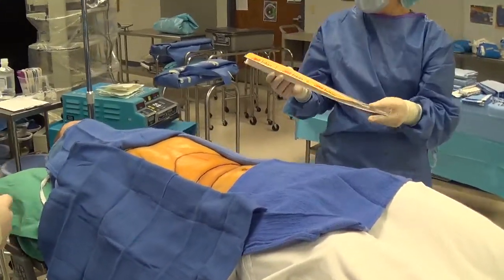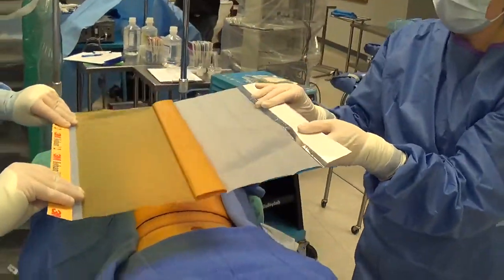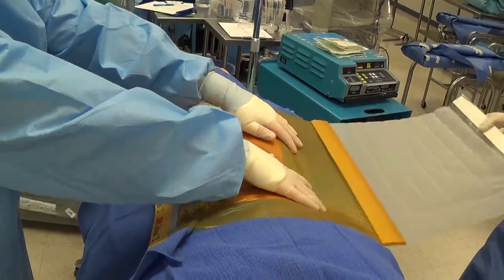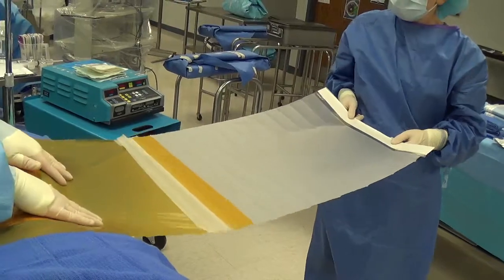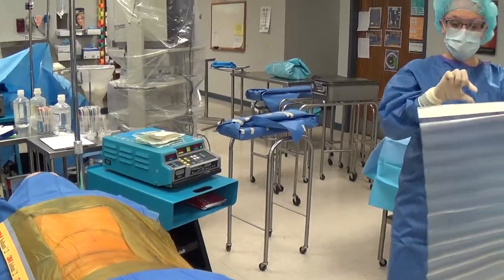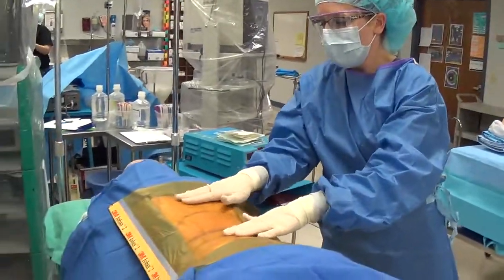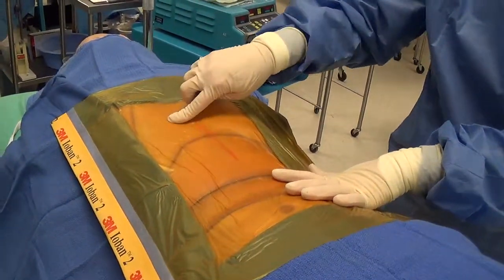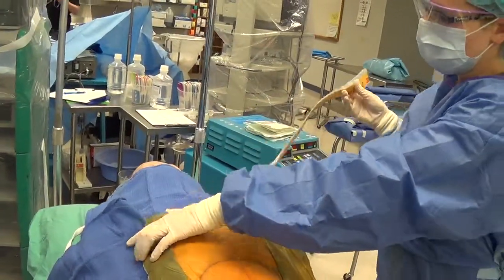When draping with your surgeon, hand them the writing side — you grab the paper backing. The person with the writing side is in charge of sticking it down and preventing any wrinkles or bubbles. The other person continues to pull straight out — not downward, so you don't go below table level — and as it hangs down, hand it off to an unsterile person who places it in the trash. If any bubbles form in the Ioban after application, the surgeon will nick it with a scalpel and stick it down, then remove that piece of paper by pulling it off and handing it to the circulating nurse.